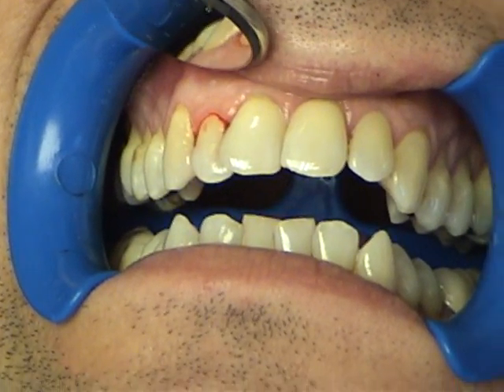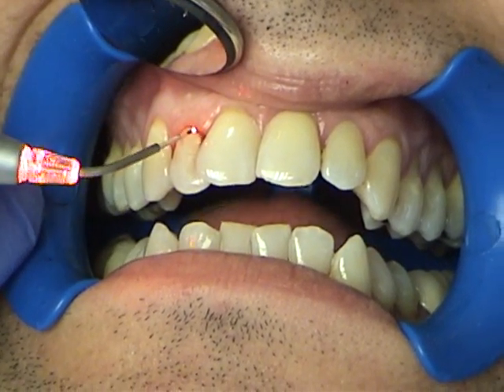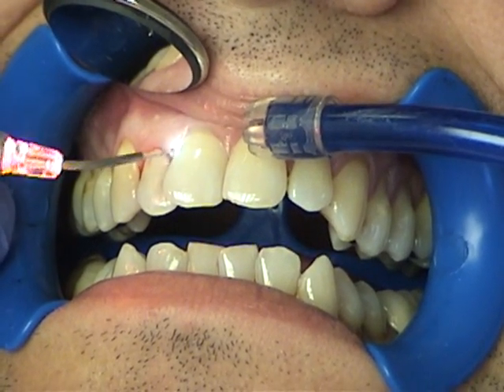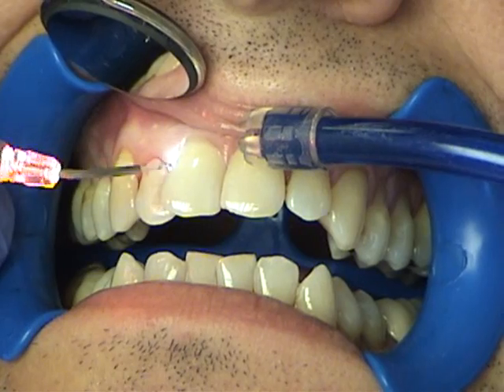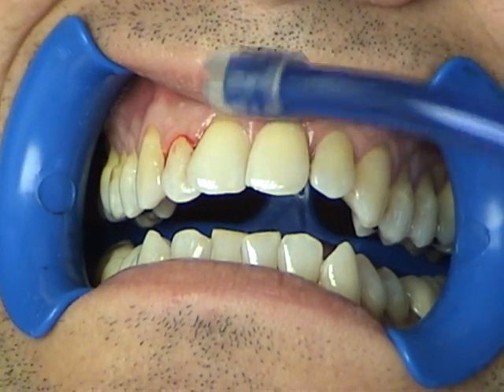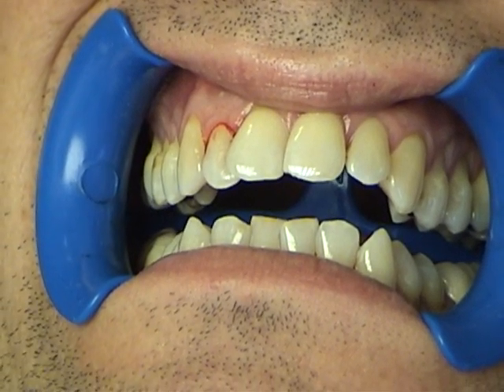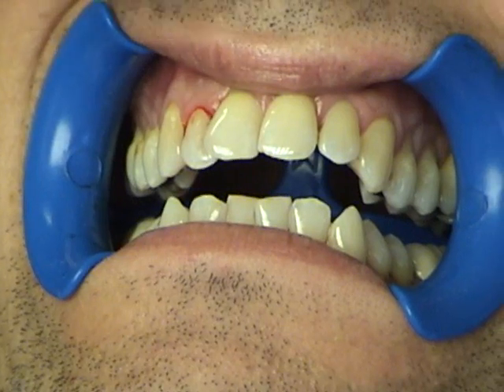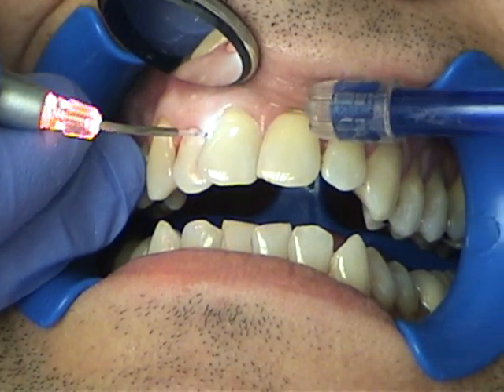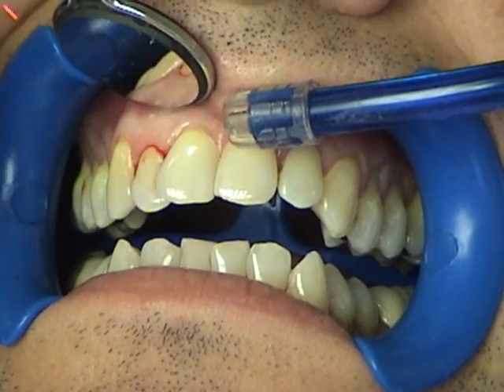John's a very sensitive guy, so we're starting off at one watt continuous wave. We're not getting any action on the laser, so I'm going to boost it up a couple of tenths of a watt. We're at 1.4 watts. Usually I work between 1 and 1.5 watts. There we go — starting to get a little bit of action.